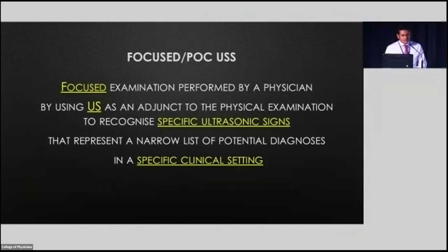So, focused ultrasound. There are a lot of words in this paragraph, but I want to highlight important words like focused. It's a focused examination performed by a physician using ultrasound, and it's an adjunct to the physical examination to recognize specific ultrasonic signs. It represents a narrow list of potential diagnoses in a specific clinical setting. Those highlighted words are really important. What do we really mean by focused ultrasonography?